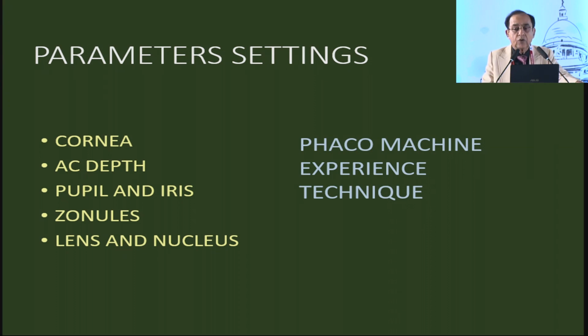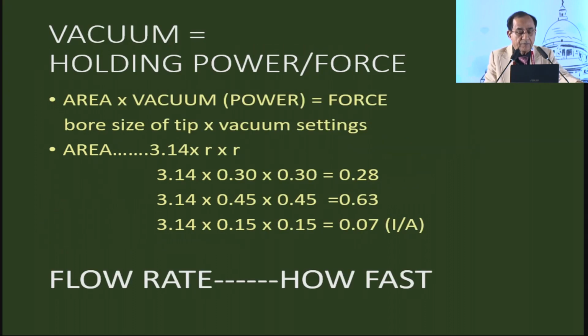The setting will also depend upon the type of machine you have, whether a third generation or fourth generation machine, what experience you have, what technique you are going to adopt, and which step of the surgery you are at.